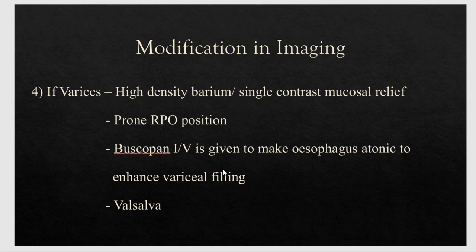We want to make the varices prominent so that they can be clearly diagnosed and assessed. So Buscopan IV is required to make the variceal filling more.